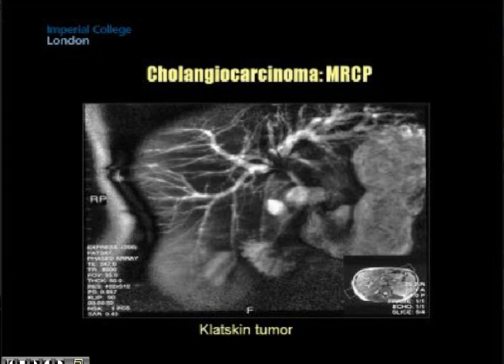The equivalent MRCP, again in this particular case, is not going to define the extent of the tumor. You can see the dilatation of the left and right biliary tree, and the common hepatic duct here is fairly decompressed. But the mass really lies in this area here.